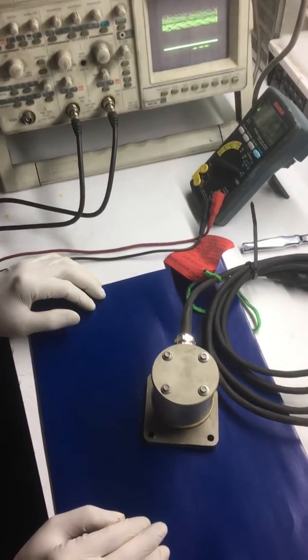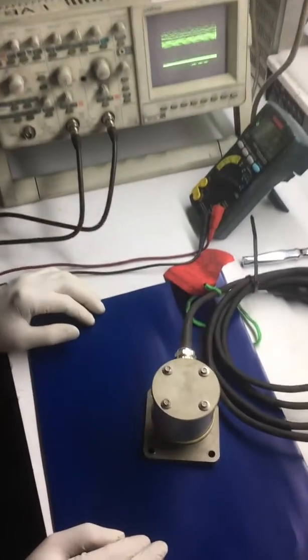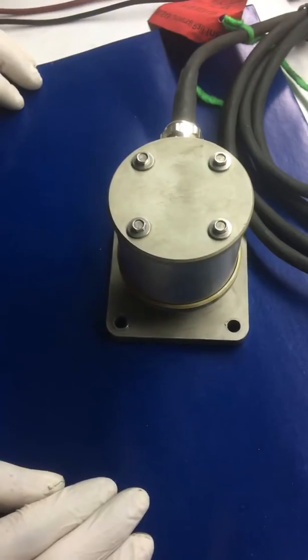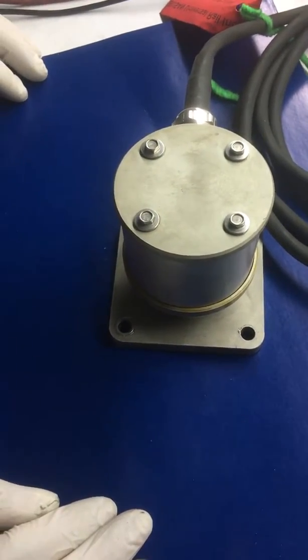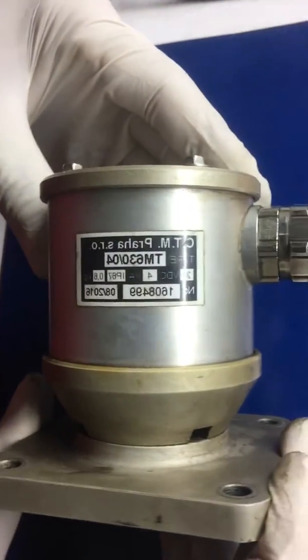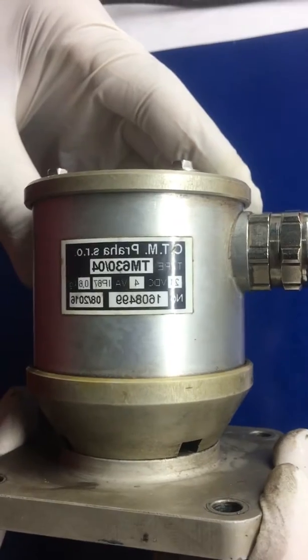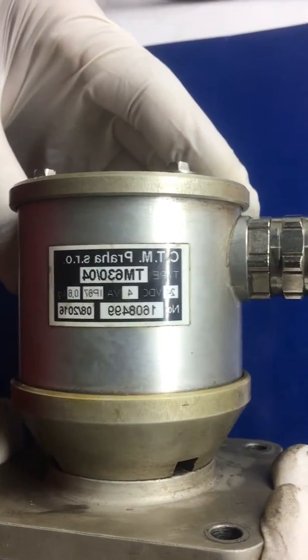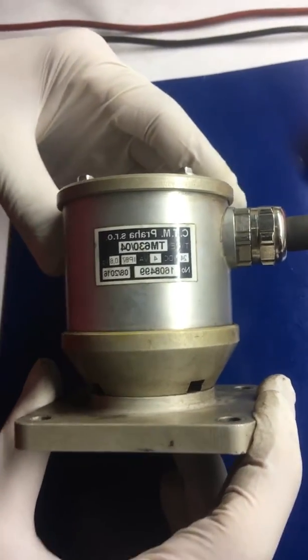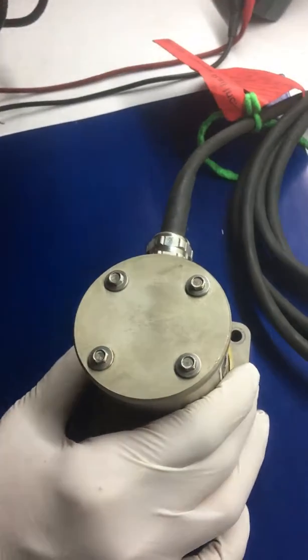This is how we are going to repair the ATP sensors in our laboratory. As you can see, the item found to be defective — I can show you the label. This is the TM630 speed sensor and its serial number. What we are going to do now is to open the item as authorized by the supplier.